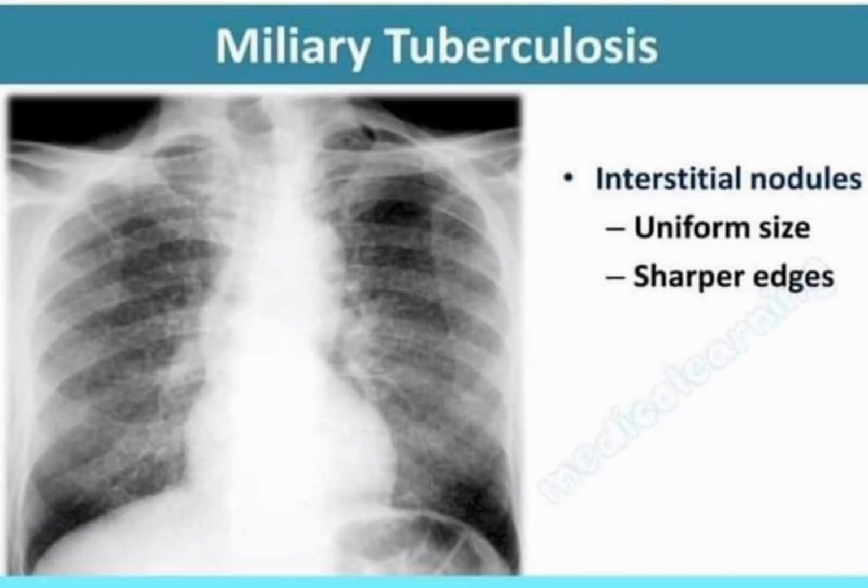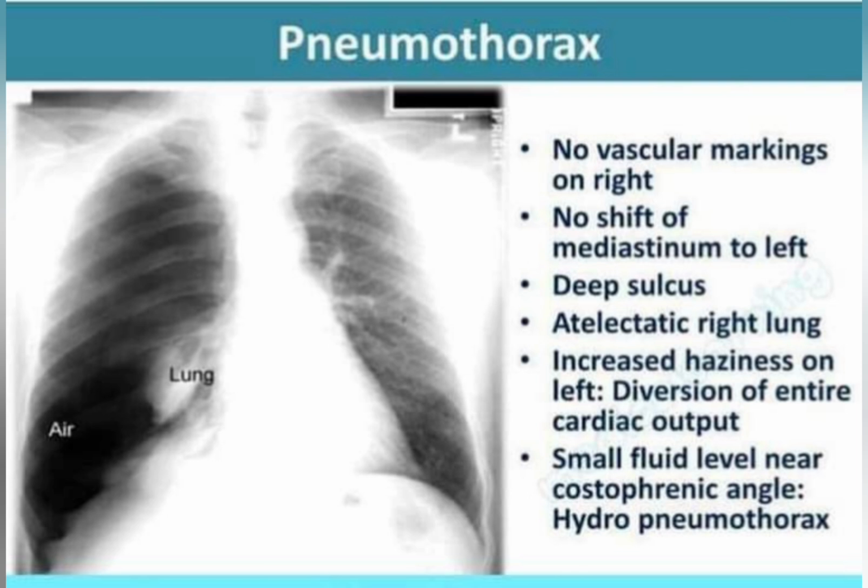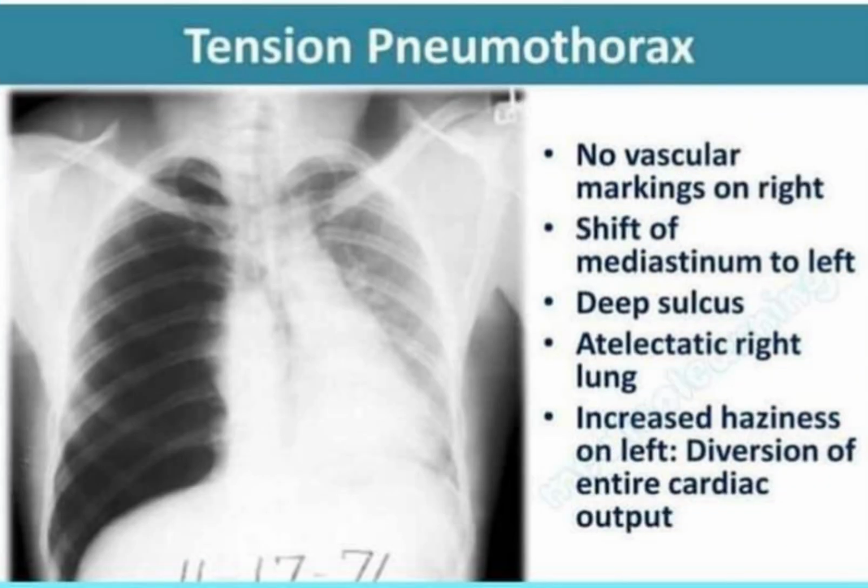Changes in the size and shape of your heart may indicate heart failure, fluid around the heart or heart valve problems. Blood vessels. Because the outlines of the large vessels near your heart, the aorta and pulmonary arteries and veins, are visible on X-rays, they may reveal aortic aneurysms, other blood vessel problems or congenital heart disease.